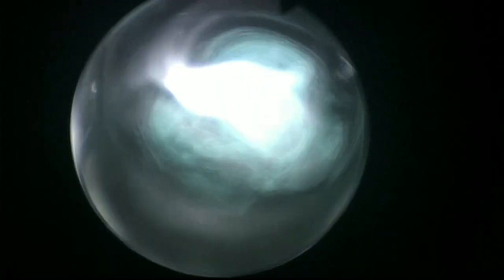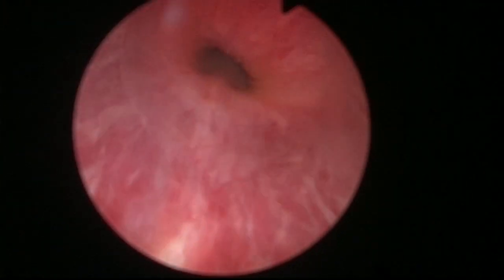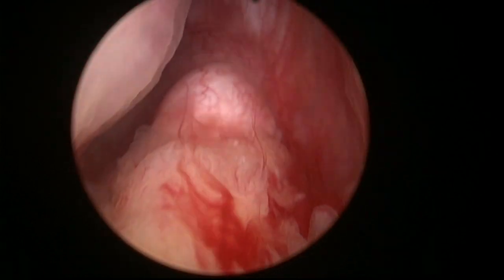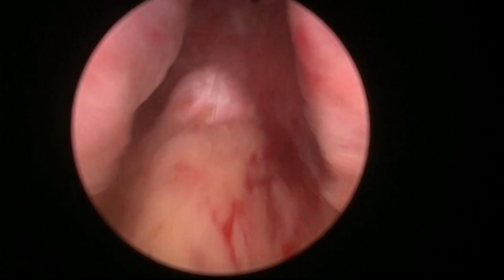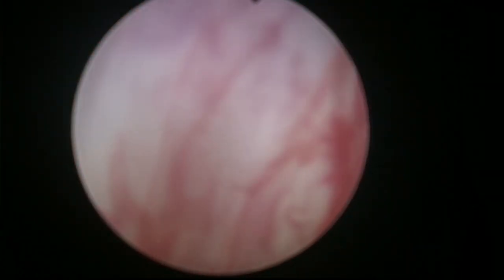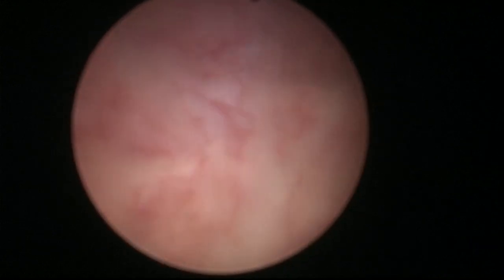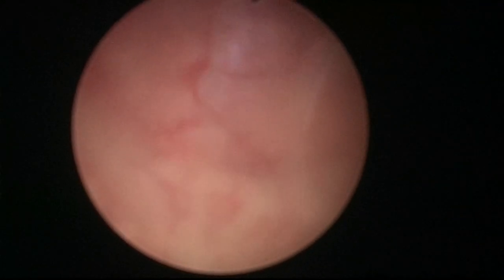All right, so we have downgraded the scope also. We are using a 24 French. So I did an Otis urethrotomy, and now with the 24 you see it's much easier, so it won't cause any forcing of the urethra. That's the sphincter, and that's the prostate, which has a bulge here, a middle lobe. So we are going to introduce the fiber, and we will be starting in no time.